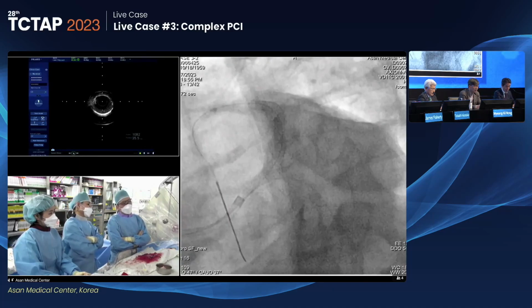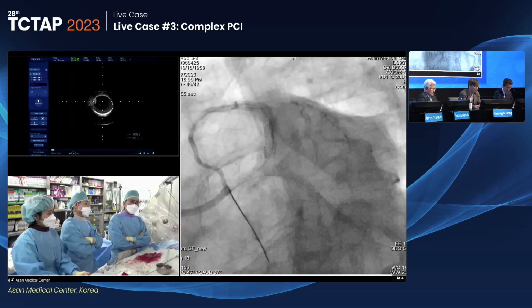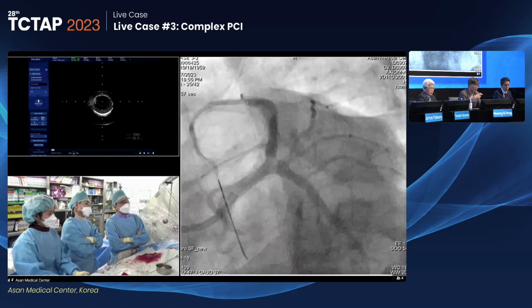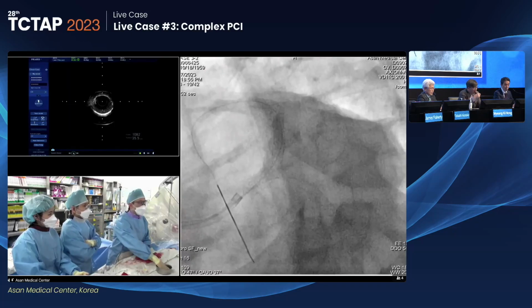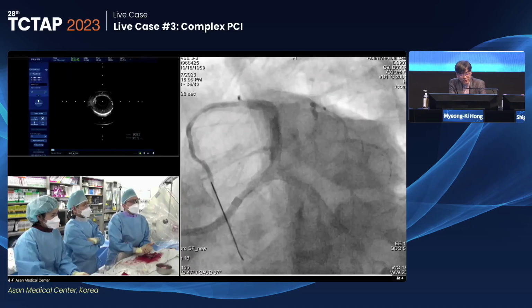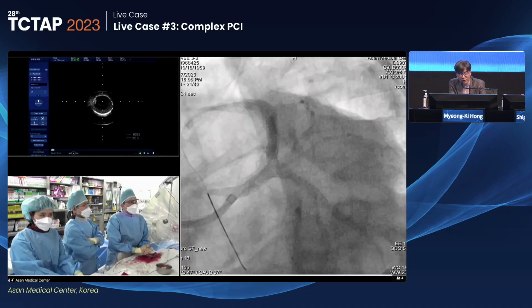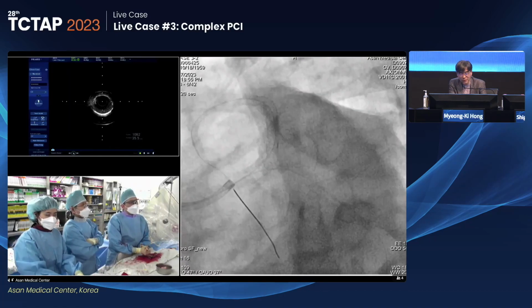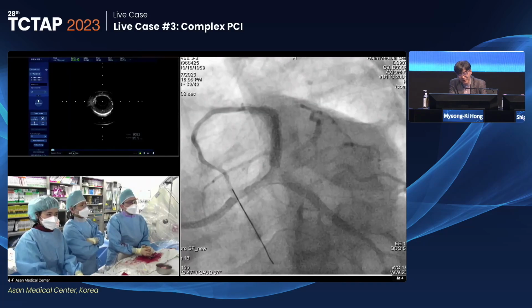And for the patient's safety, about ending the procedure here, I want to ask your opinion, the expert panelists and moderators. This is my personal bias. You are so skillful. You did every step of the procedure from beginning to end without any hesitation. Every step was a textbook, wonderful procedure, even though the patient is so high-risk.